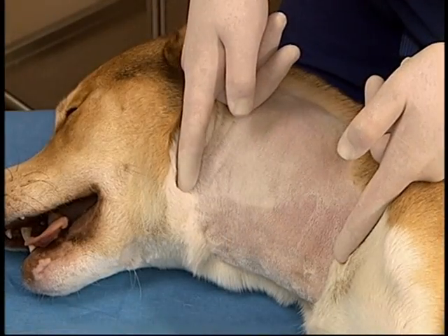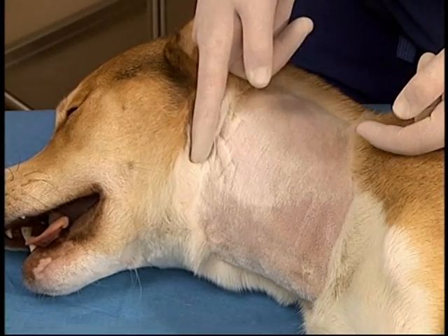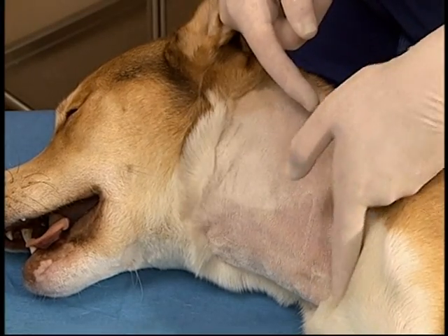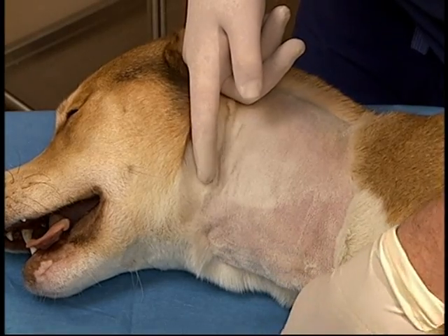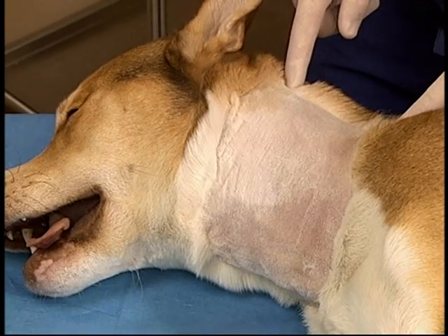The animal is clipped, surgically prepped, and drapes are placed. The drapes are being left off for visualization purposes. The clip should extend from the dorsal midline to lateral to the ventral midline, and from the angle of the mandible to the thoracic inlet.